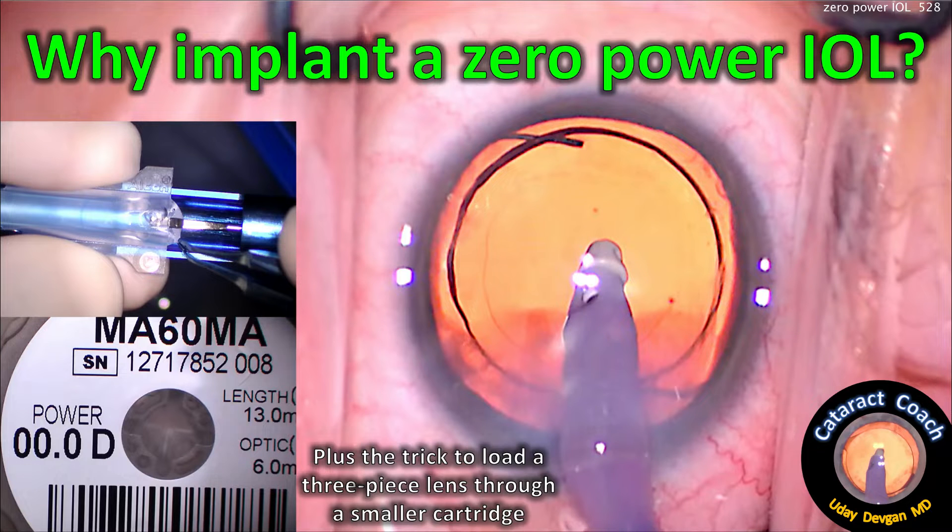CataractCoach.com — Why implant a zero-power IOL? Plus the trick to load a three-piece lens through a smaller cartridge.